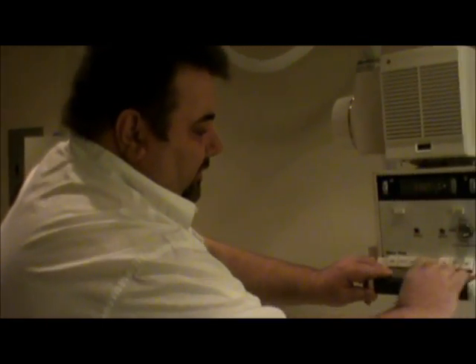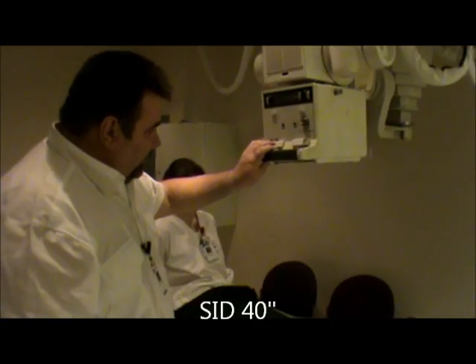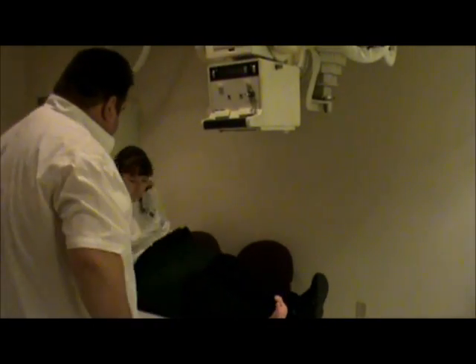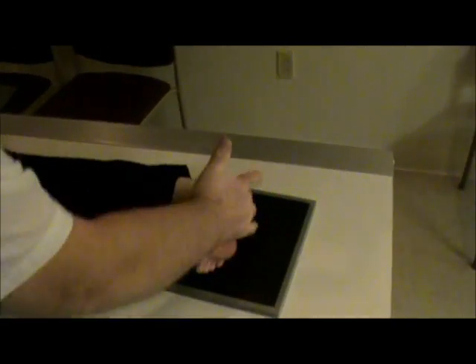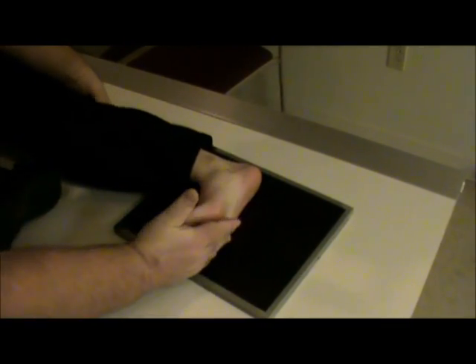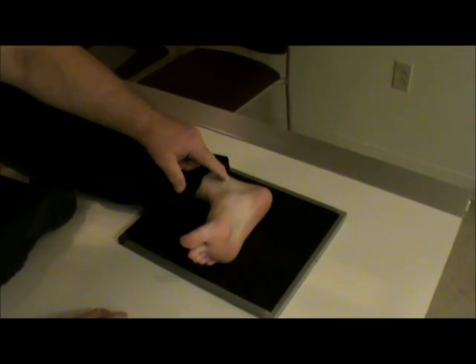Our next view is going to be our lateral. We're going to take our tube angle off. I should mention it is going to be a 40-inch SID for both the axial and for the lateral projection. We're going to have the patient roll onto their right side, roll up toward me. We're going to have the patient dorsiflex the foot, and just like we do for a lateral foot, we're going to bring the knee up until we get the plantar surface perpendicular to the IR. Our centering for this is going to be about one inch inferior to the medial malleolus.